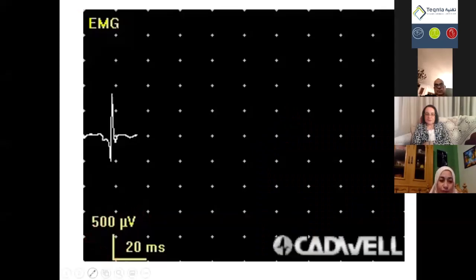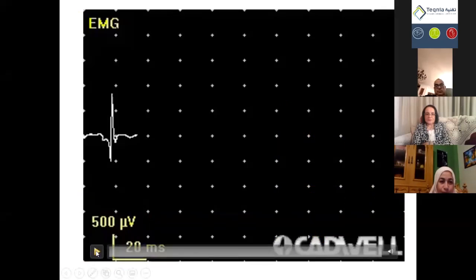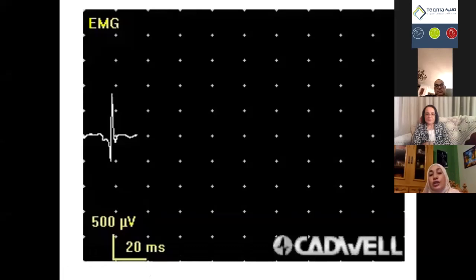This is another video. These are normal motor units with mild contraction reaching maximum contraction.